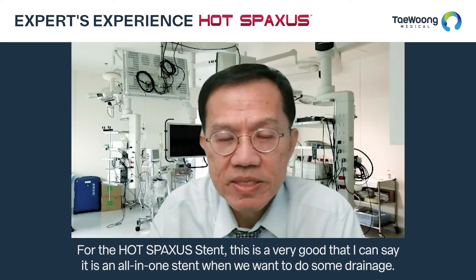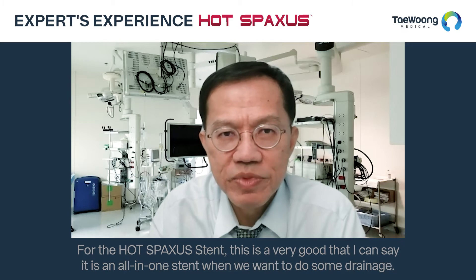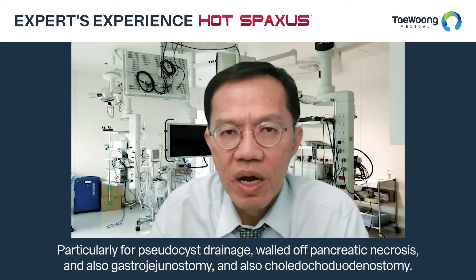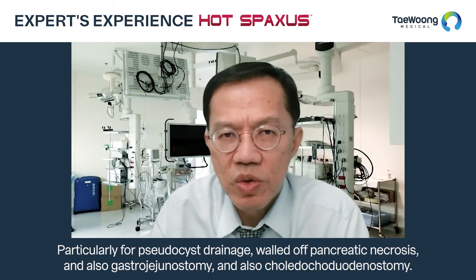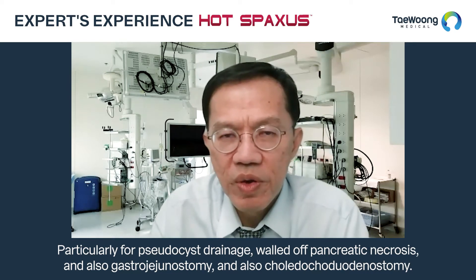For the HOT SPAXUS stent, this is a very good stent — all-in-one — when we want to do some drainage, particularly for pseudocyst drainage, walled-off pancreatic necrosis, and also gastrojejunostomy and choledochoduodenostomy.